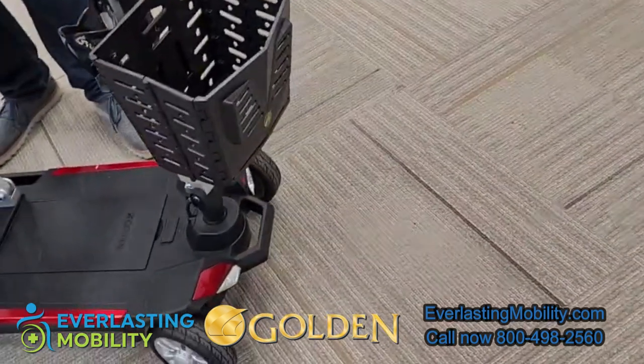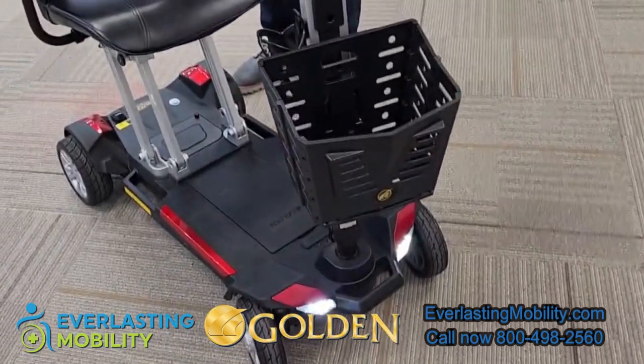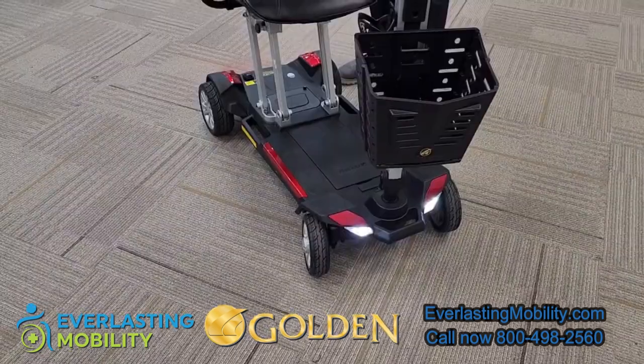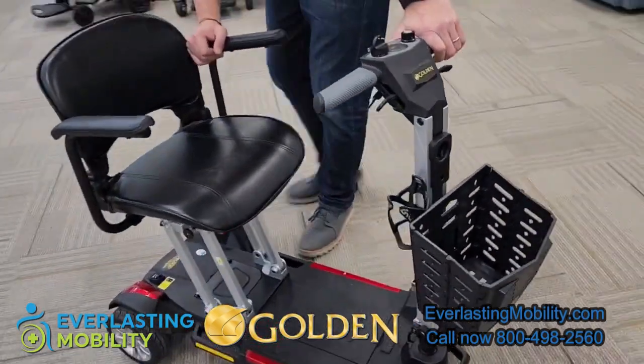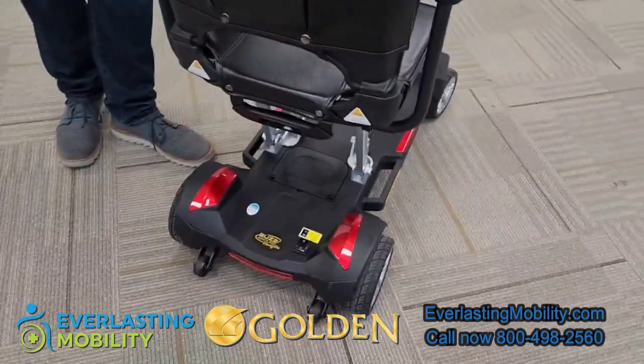There is a front headlight on the scooter — two lights on the front — so if you're riding at night time it illuminates the path in front of you pretty well. There's also a rear light on the back that lights up once you turn on the lighting system, so you have a lot of visibility when riding at night.